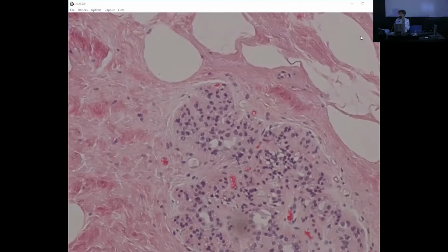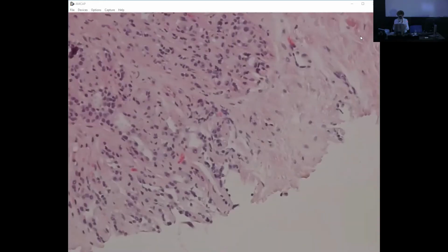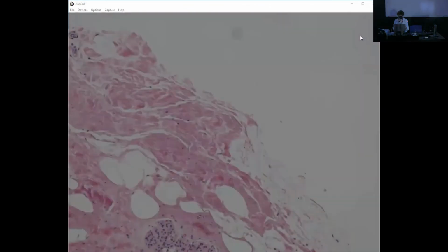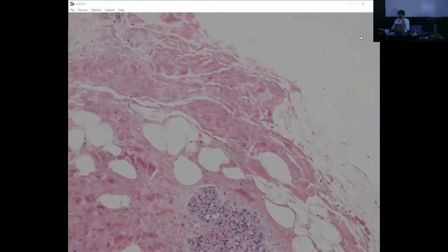Sorry? Myoepithelial, excellent. Mimicking lobular neoplasia, terrific. So this is a focus of myoepithelial hyperplasia. Why did you say myoepithelial proliferation? All right, well, you got it. So I hope I can demonstrate that with the P63 stain. It's a very focal finding.